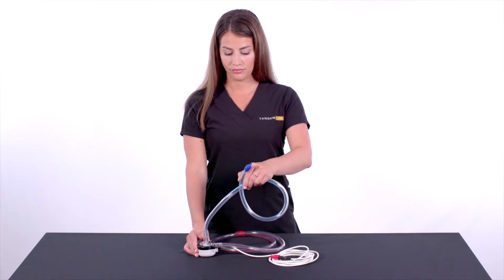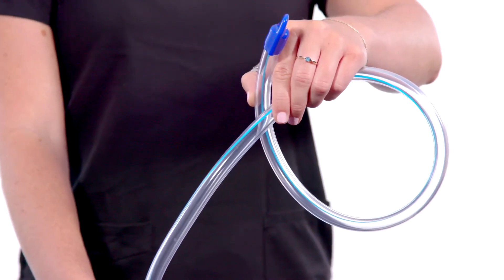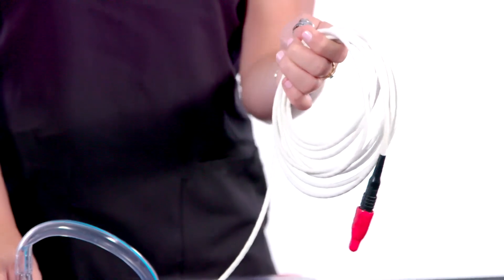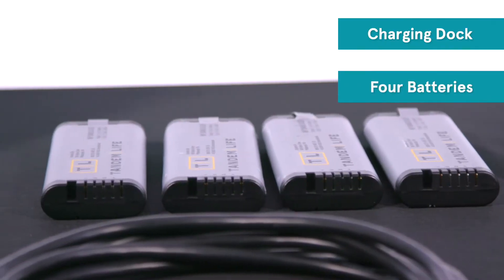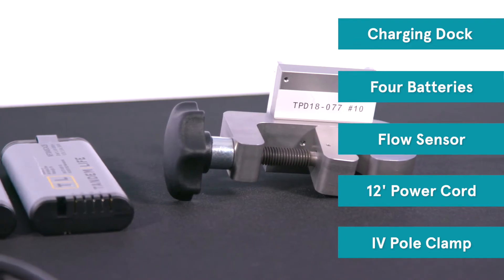The pump is shipped with a pre-attached pump inflow tubing indicated by the blue stripe, pump outflow tubing indicated by the red stripe, and a 12-foot pump power drive line which connects to the controller. The LifeSpark controller includes a charging dock, four batteries, a flow sensor, a 12-foot power cord, and an IV pole clamp.